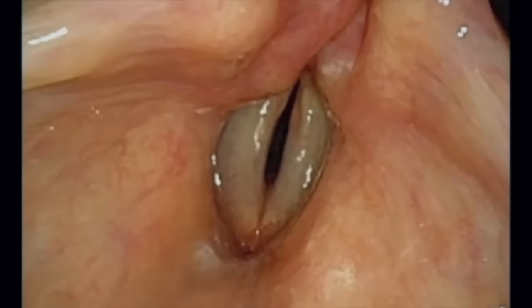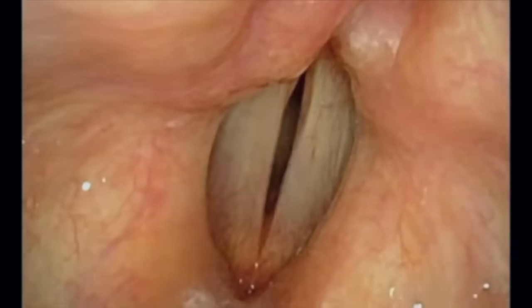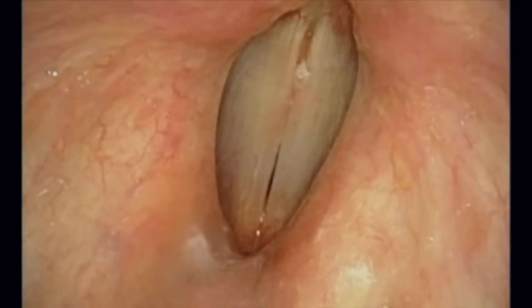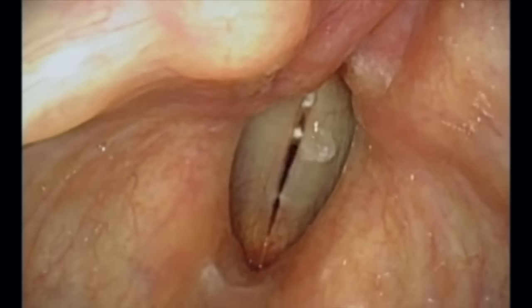As shown here, the vocal cords themselves can also adjust their thickness and tension to adjust pitch. Just like a violin string, the thinner and tighter the string, the higher the pitch. The thicker and looser the string, the lower the pitch.